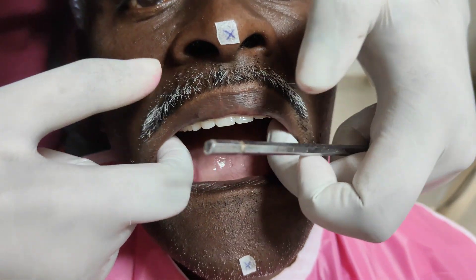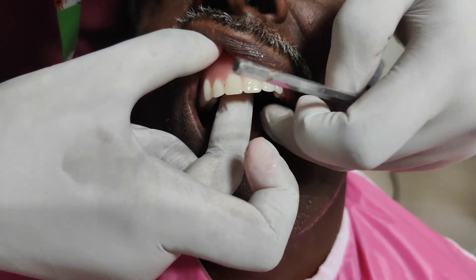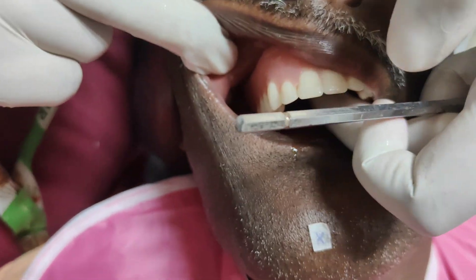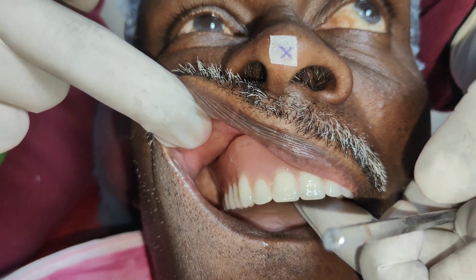Peripheral adaptation and extension of the denture should be checked after inserting the denture in the patient's mouth. First, the frenal relief should be checked. The labial frenum and the buccal frenum on both right and left sides should be checked first.